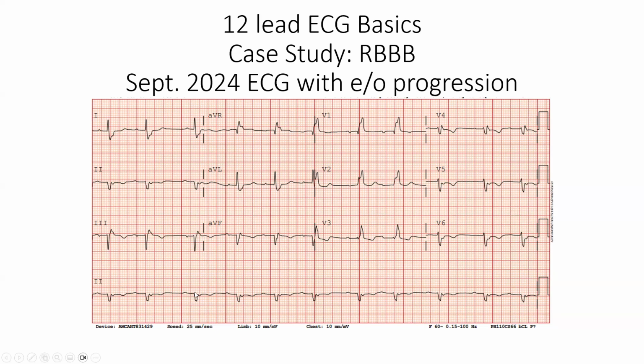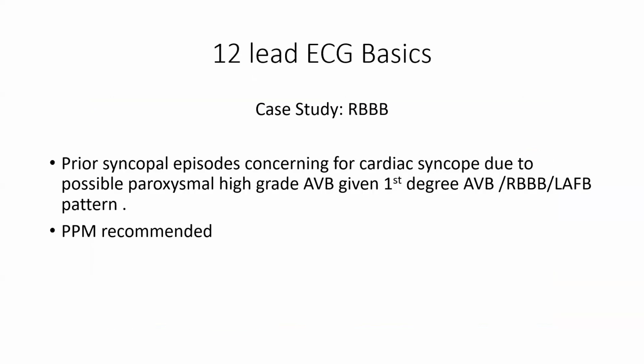We also had a concern that there's a mild first degree AV block representing conduction disease, and so this patient was recommended to have a pacemaker.